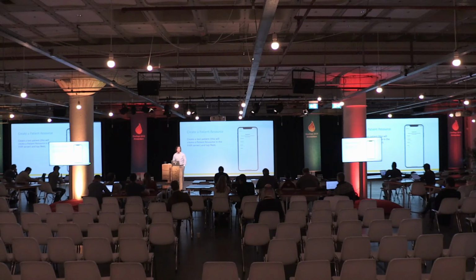Okay, and after you sign in, what's going to happen here is the iOS application is going to reach out to the FHIR server and check to see if there's been a patient created for this device. So essentially, you've logged in with this user, and it looks to see if there's a patient resource. It sees that it's a completely brand new environment, so it has you create a patient. Just create a test patient. You can fill out first, last name, birth date, and then just hit next. So this is going to actually create a patient resource in your FHIR server.